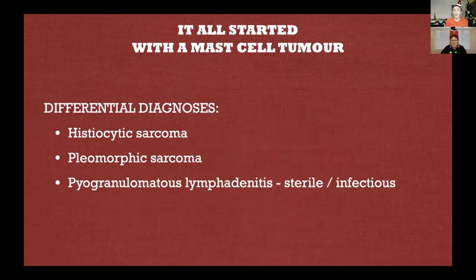So yeah, I always do that too, though. I sit there and think, am I going to give this animal something malignant, and these are just macrophages? But then you find those huge ones and you think, oh, thank you. Thank you for making this a little more clear. Sometimes we still will include it on there, like you're saying, that it's like, that's not what it is.